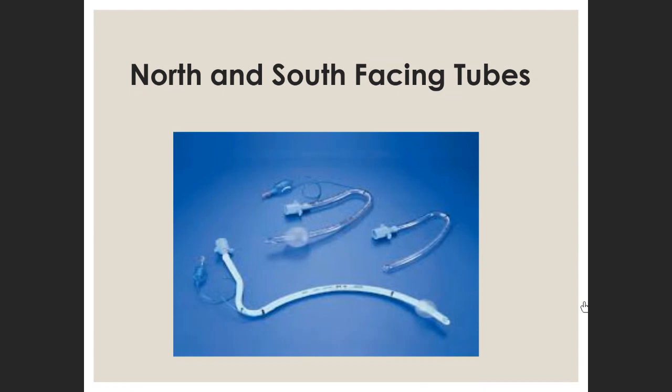South facing. Good job. But if you notice, one is cuffed and one is uncuffed. So even in these special tubes, you can have cuffed or uncuffed tubes. All right?